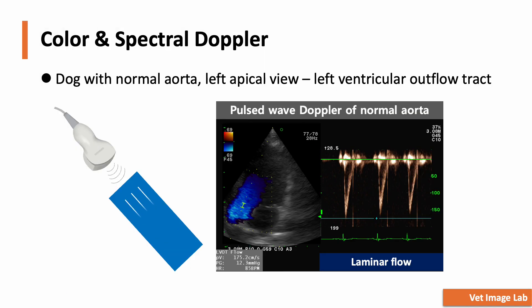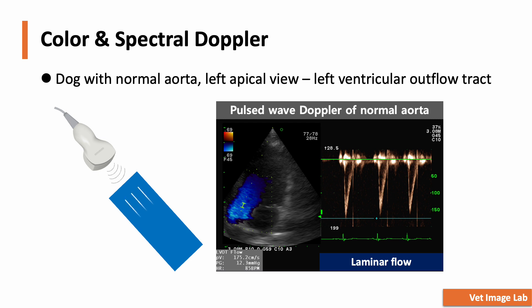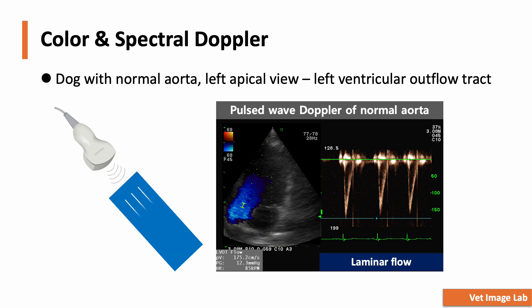Now let's look at color and spectral Doppler application using an example from a normal dog. We see a left apical four-chamber view focusing on the left ventricular outflow tract. The color Doppler overlay shows a laminar flow pattern — smooth and organized blood flow. The blue color indicates that blood is flowing away from the transducer, which is expected in this view of the left ventricular outflow tract. On the right, we have the pulsed wave Doppler recording from the same location. The spectral Doppler waveform shows a clean narrow velocity profile, further confirming laminar flow. The peak velocity is around 175 centimeters per second, which is within the normal range for the left ventricular outflow tract.